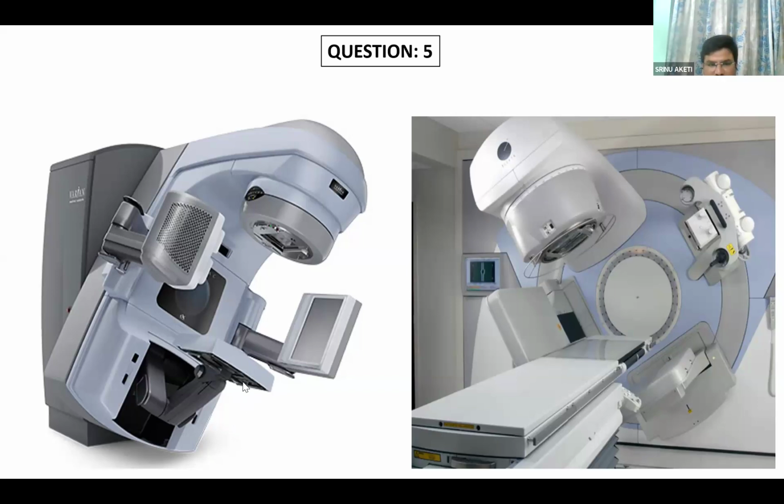No, this one, you can see my cursor. This one you are talking, you said it is a beam stopper. Am I right? Yes, sir. This is not a beam stopper, it is an EPID. We call it a portal imaging panel. For MV imaging, we take a 2D image. We will mark the bony landmarks and match it with the DRR.